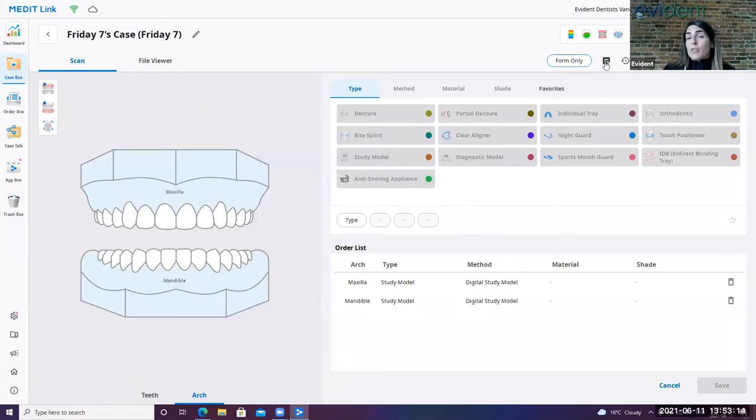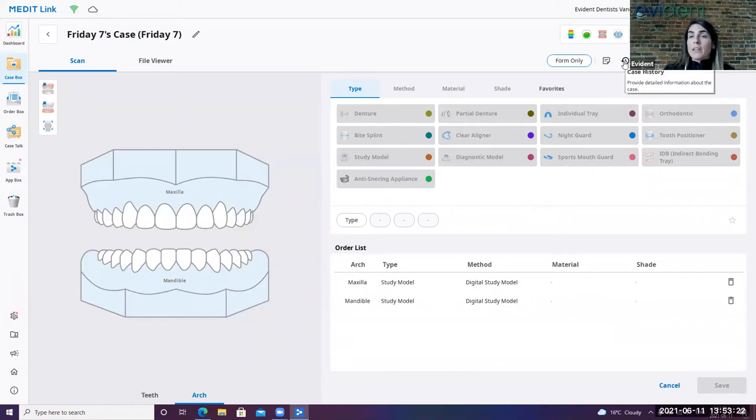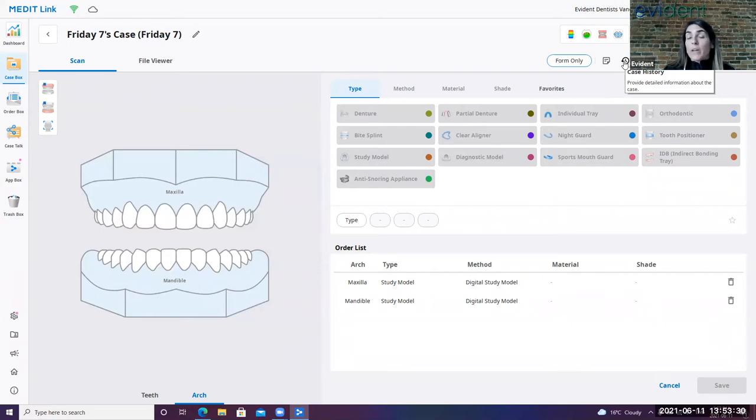As I've mentioned earlier, there's this memo button in order for you to be able to indicate specific notations for your lab. You can also look at your case history. So when the case was created, scanned, and last modified, that can be helpful if you're a bigger practice, and you've got multiple people going into those cases. And sometimes it's important to know when it was last modified to ensure that you're sending the most recent and updated scan.